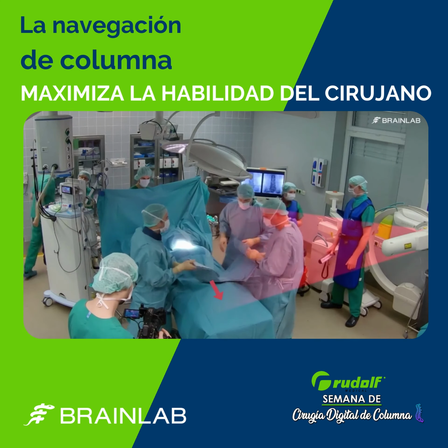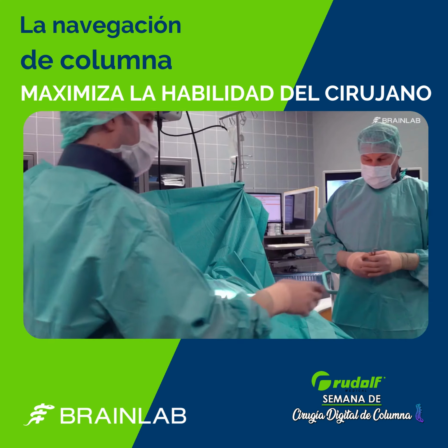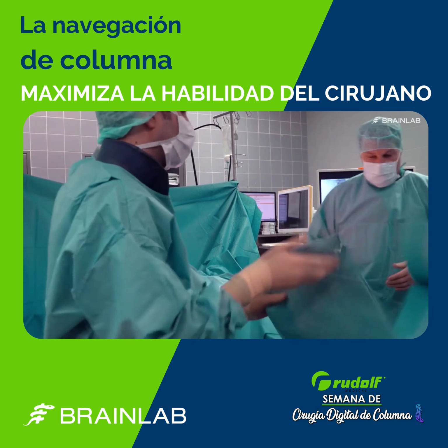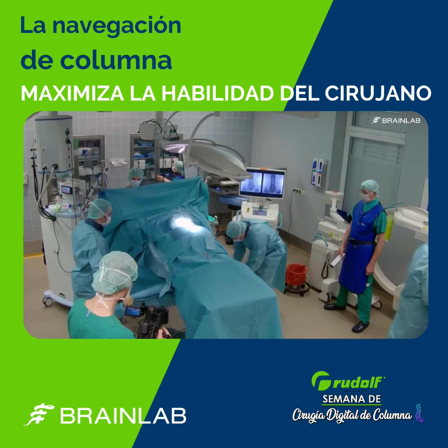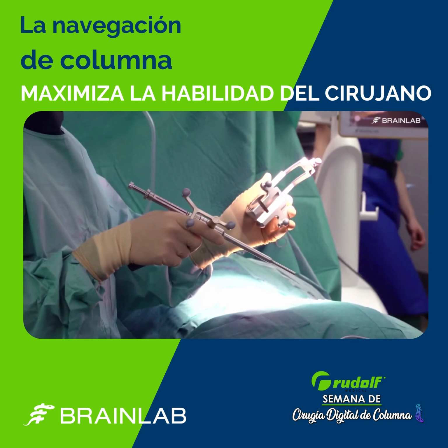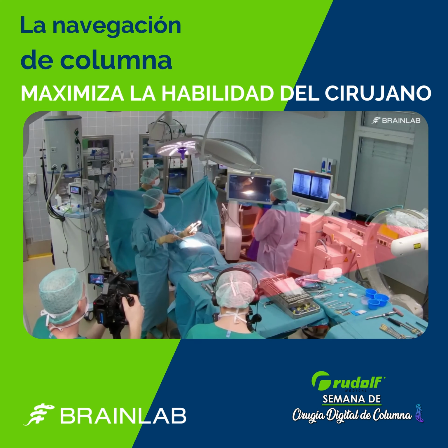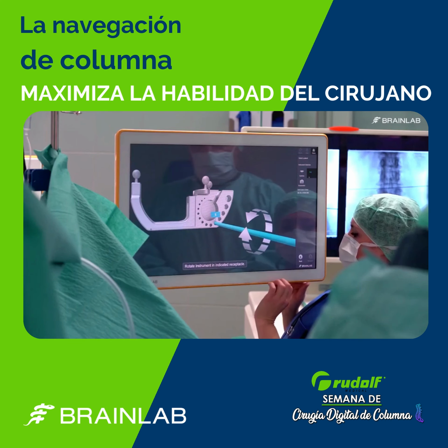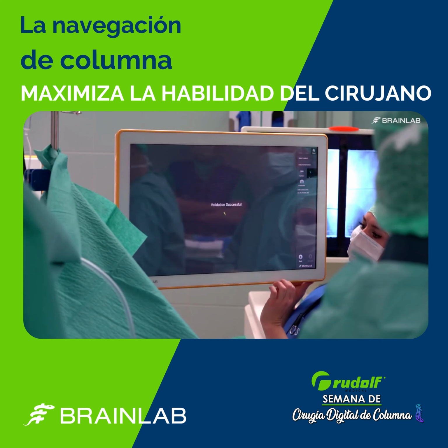The patient is placed in a prone position with the feet facing the infrared camera. Drapes are wrapped tightly under the operating table and around the patient to allow the use of the C-arm without compromising sterility. By pointing the calibration matrix and a drill guide in the direction of the infrared camera, the instrument application starts automatically. Calibration is then performed by inserting the drill guide.